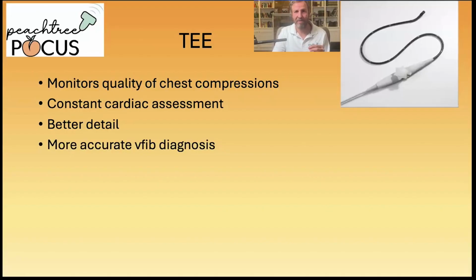And lastly, it can give you a more accurate diagnosis of rhythms like ventricular fibrillation. Remember how I said fine VFib can sometimes masquerade as asystole? So with TEE, you can often see it more clearly in real time. So TEE offers constant detailed cardiac assessment throughout the resuscitation without worrying about the pauses.